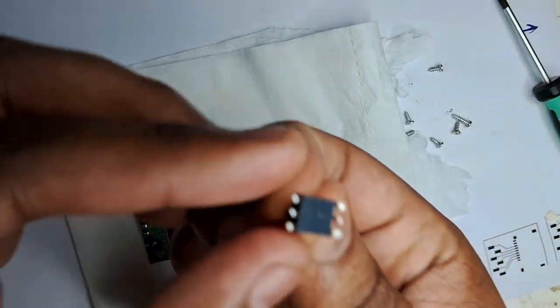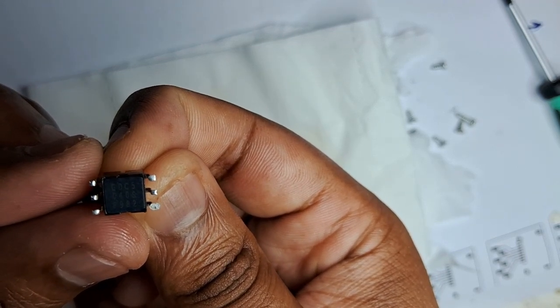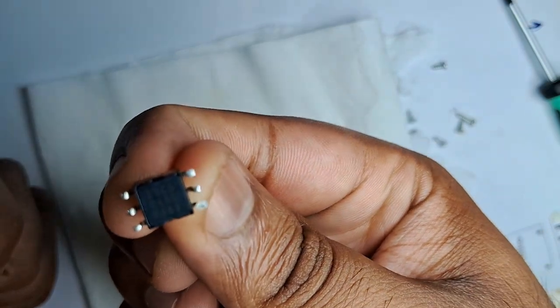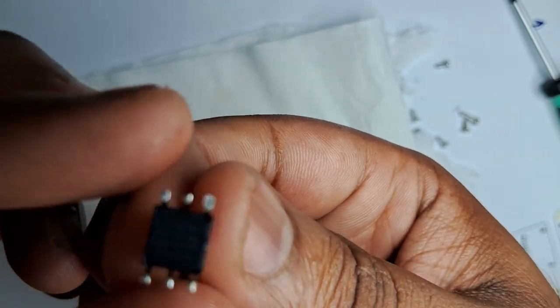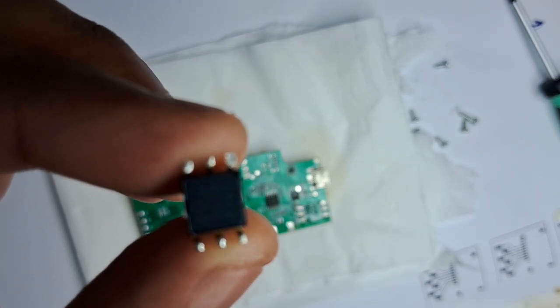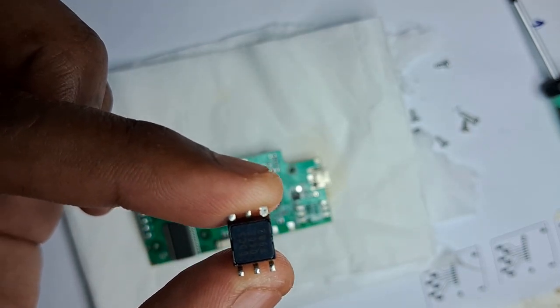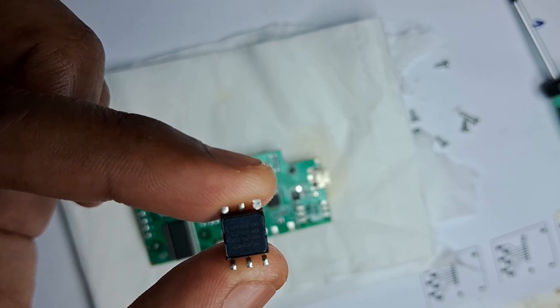Okay. As you can see, we have successfully removed this and you might be able to read some of the part numbers that is written over there. Now we will go to Google and find out the data sheet for this guy and we will see the specifications of the sensor. How is it working? I think it is not properly getting focused. So let's see whether you are able to see. I'm very sorry for this, but I'll definitely give the number of this sensor. Now I think you might be able to see the specific part number of the sensor.